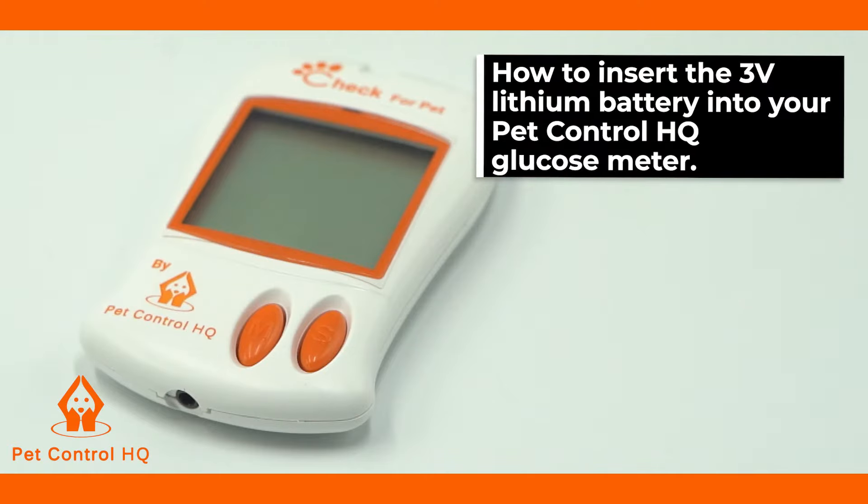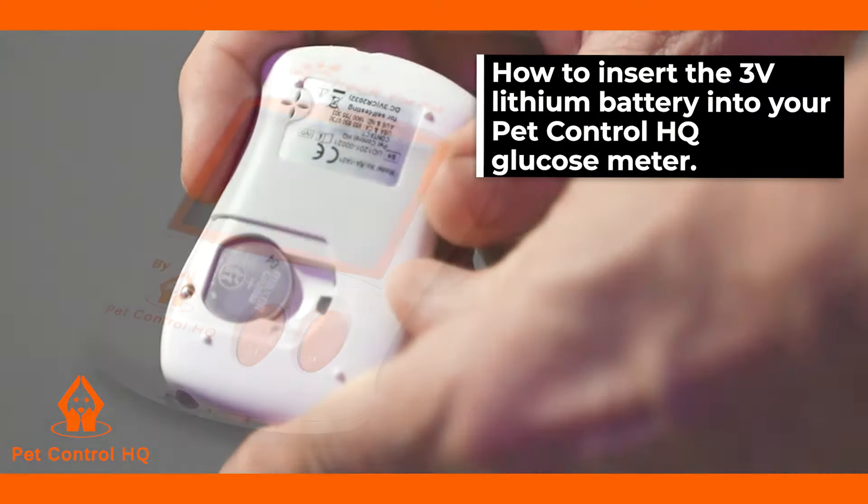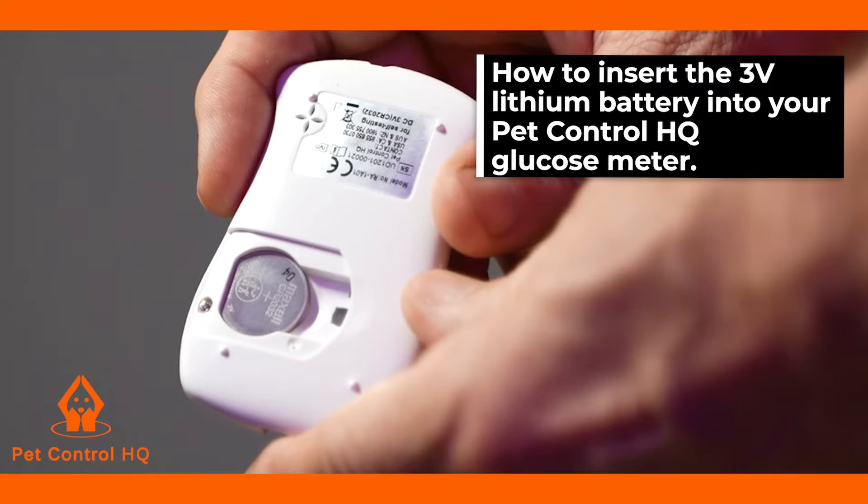This is a brief overview on how to insert the 3 volt lithium battery into your PET-Control HQ glucose meter.